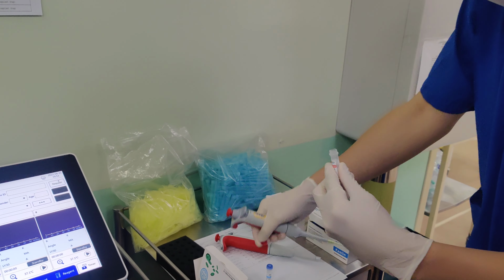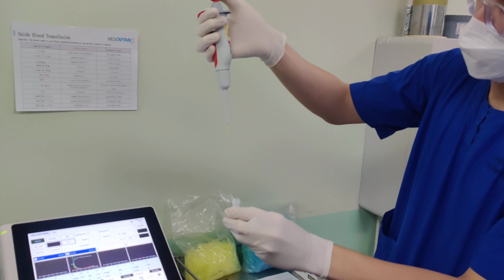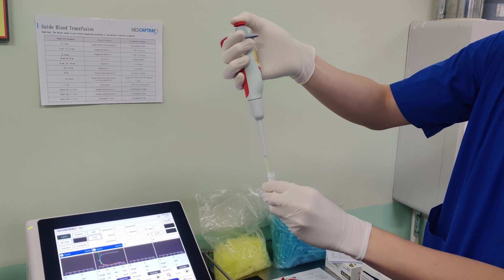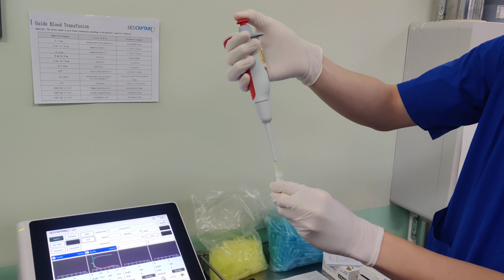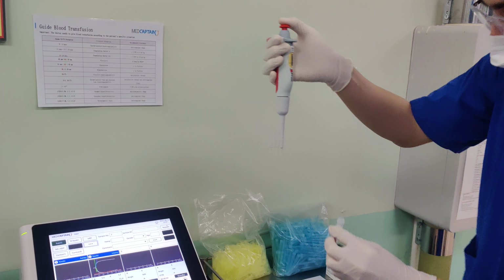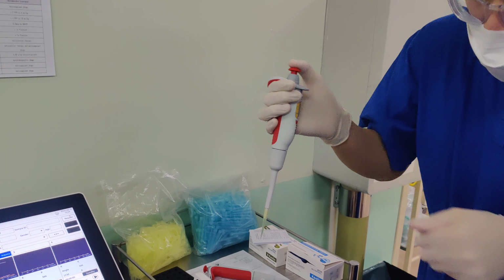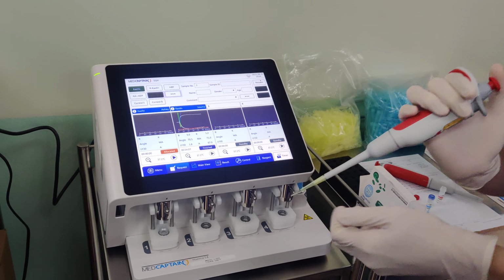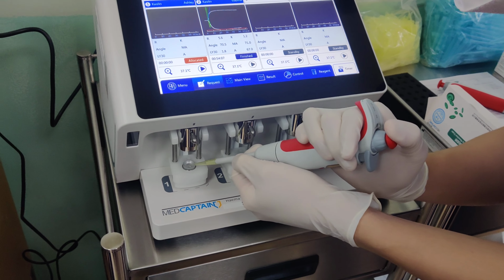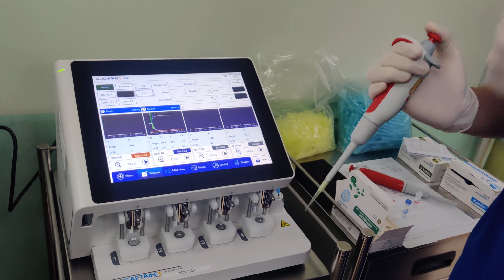Open up the trigger. How to use it? Before you enter and aspirate the liquid, you click it, okay, the first stop, enter. Once inside the liquid, you just release. And then this will be exactly the amount you set, which is 20 microliter. Okay? Then they mentioned add it into the cup to the bottom. So when we add it, the tip must be touching the wall gently, and we just push. Okay, now the cup will contain the calcium, which will add the blood later.